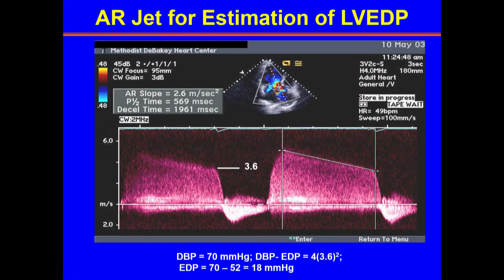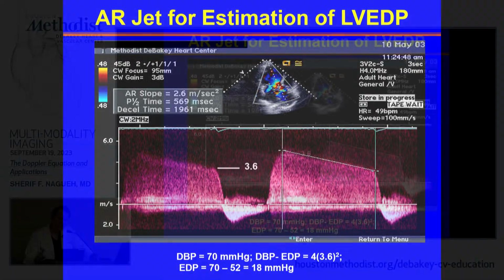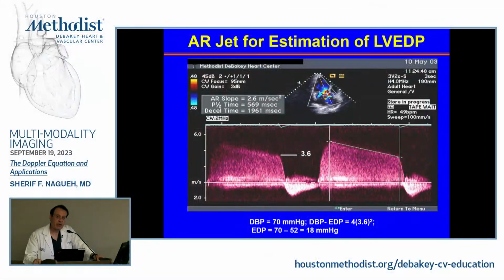There are problems with this approach, but I introduced it mostly for concepts of how to use the pressure gradients and the modified Bernoulli equation to do some estimates of actual pressures and not just pressure gradients. I'm going to stop here and we can take questions.